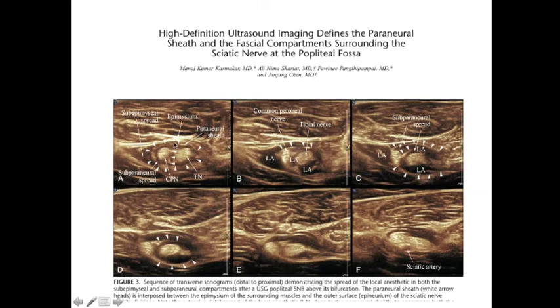If you understand that this is a sheath and the nerves are already divided, you can perform just one puncture site injection, and you can surround both terminal branches without having the needle many times, avoiding problems like neurological deficits or vascular punctures. You can just insert the needle in between them, piercing the paraneural sheath, and it will be done. Just one site to access and inject.